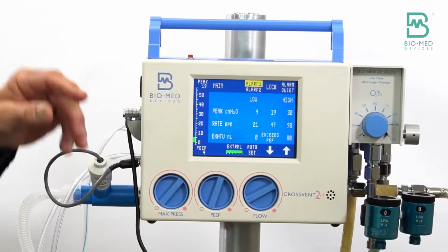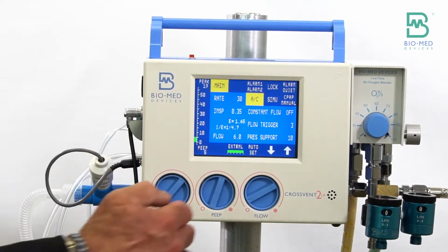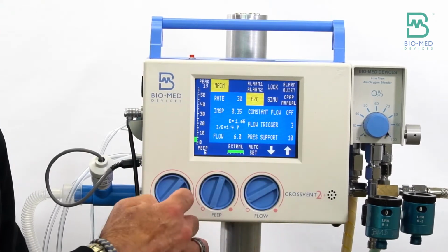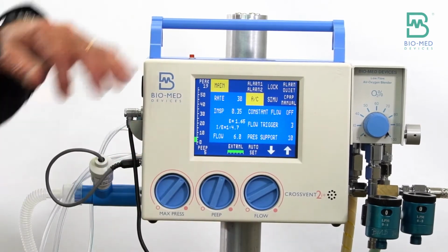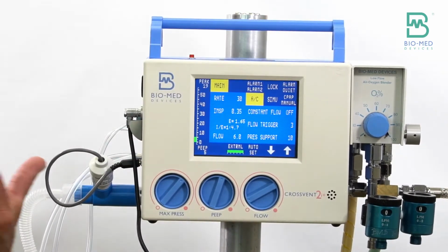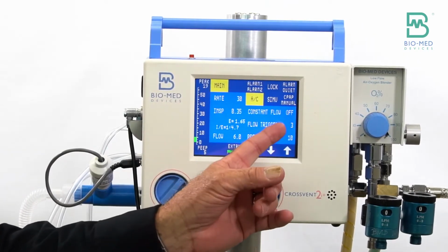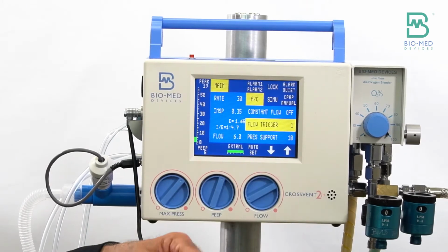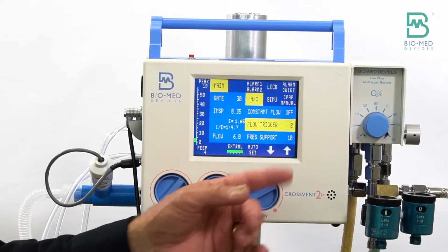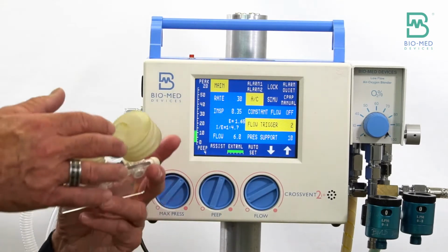As far as setting up the vent, everything you did before, set the flow, set the max pressure for your PIP, your PEEP, your rate, your I time, everything is exactly the same. The only thing we're adding is sensitivity. Sensitivity can go from 1 being the lowest and easiest to trigger.